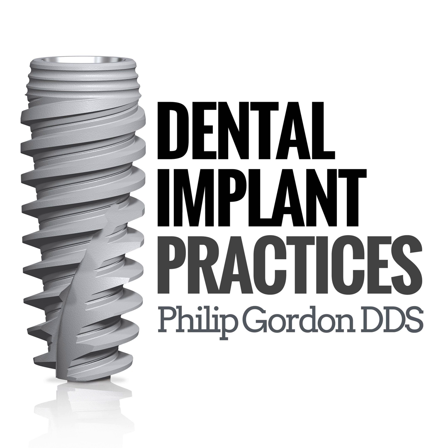Since I'm using a parallel-walled implant, and I didn't want to penetrate the subnasal fossa, I found myself tilting the implant facial. So now the abutment is going to be way to the buccal, and I have to use the severely angled abutment in order to restore it. I'm thinking to myself, if the tooth that came out had a tapered root, why am I putting a square peg in a tapered hole? If we look at the anatomy of the maxilla and the mandible in cross-section, we're looking at a series of triangles.